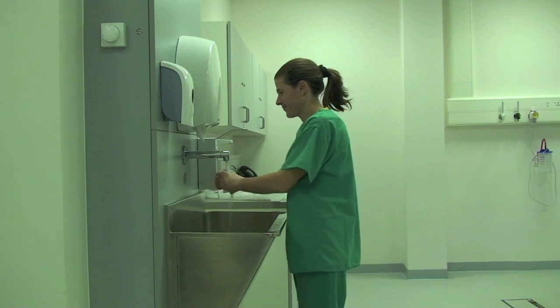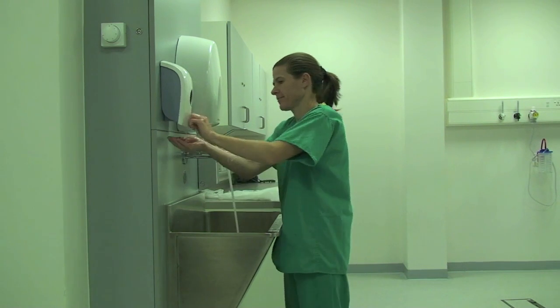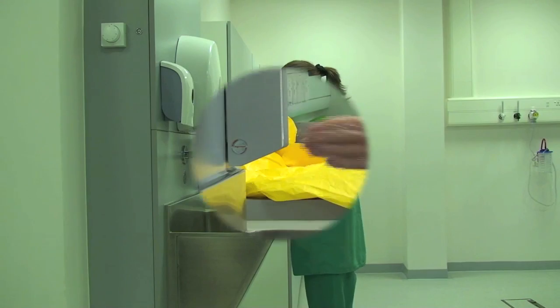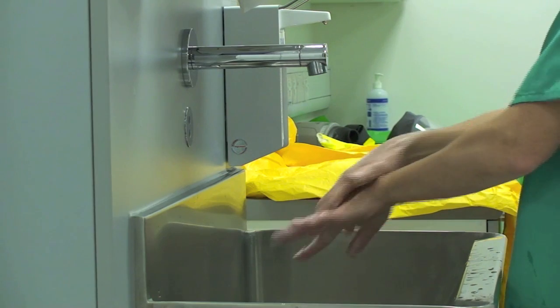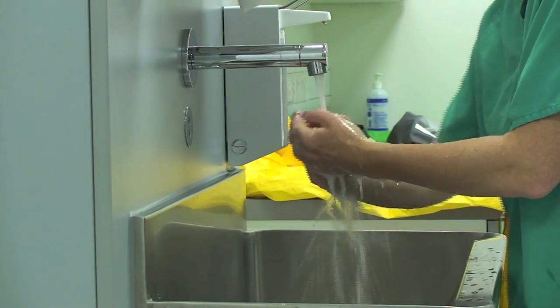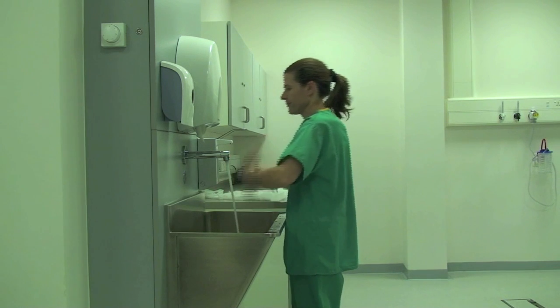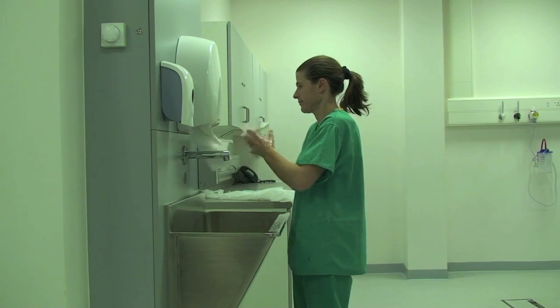Before applying PPE it is extremely important to wash your hands. First wet your hands then apply liquid soap. Create a lather covering the fingertips, palms, backs of the hands, and in between the fingers and the thumbs. Rinse the hands and dry thoroughly.